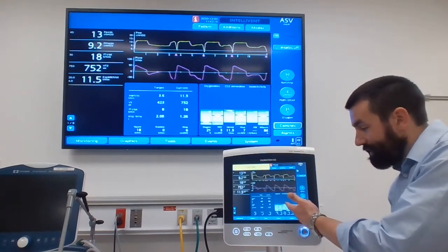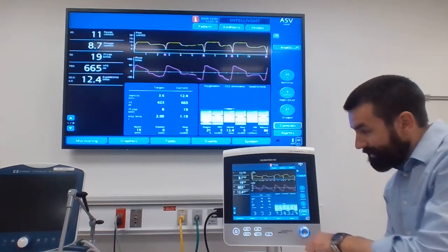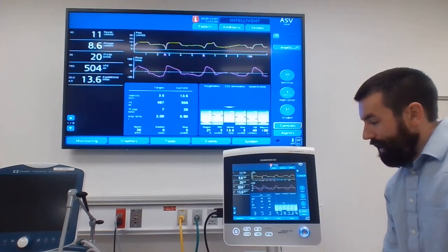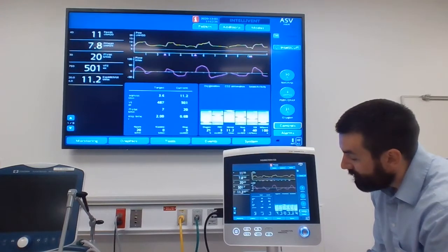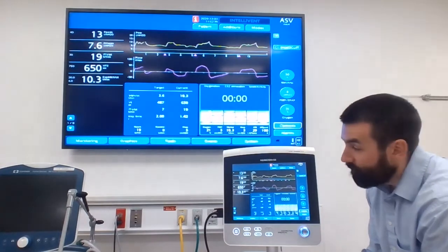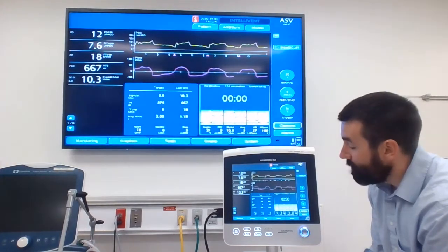So if you have this vent status on, as we start backing off and allow that patient to breathe more spontaneously, you'll see all these little icons that fall into place. I've got to breathe a little bit slower here. As that patient's situation improves and everything falls into place, we can look at these little tabs over here. And when everything is appropriate for that patient, considering their ability to be evaluated for liberation, it starts a timer.